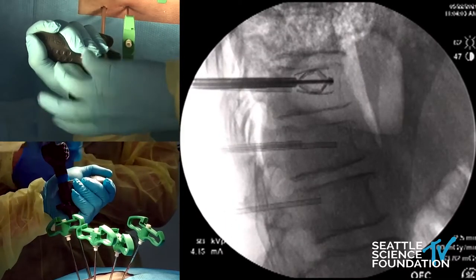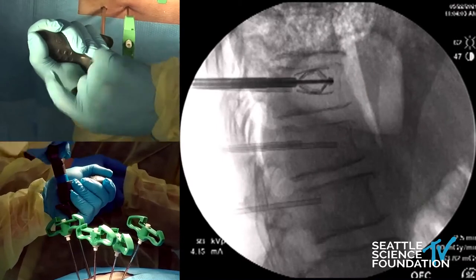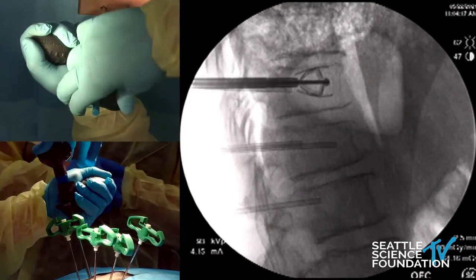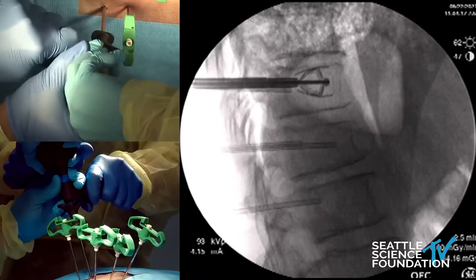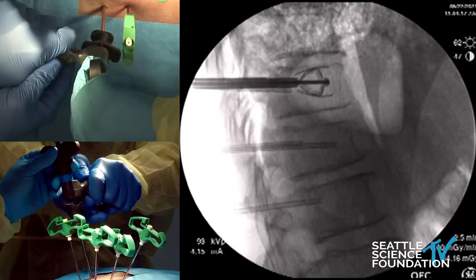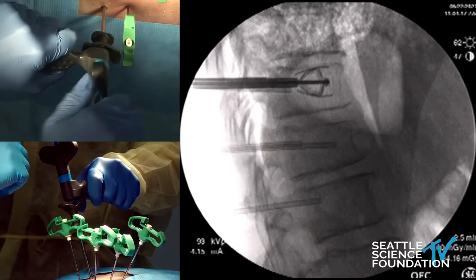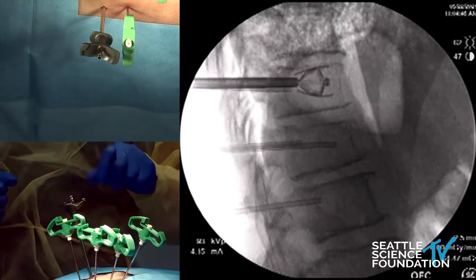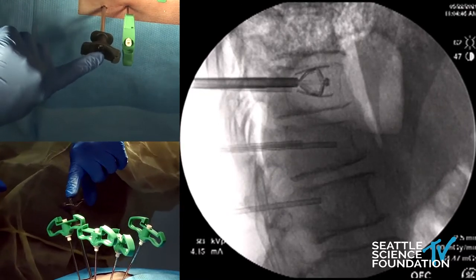You can see it's hit that end plate, and it will adjust to really lift it up. It's almost maxed out. Once it's all in, if we had not violated the anterior cortex, we could put cement behind this. This is just an adjuvant tool to give you a little bit more height.